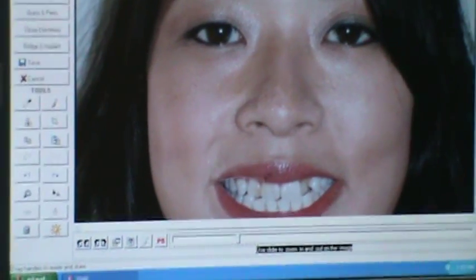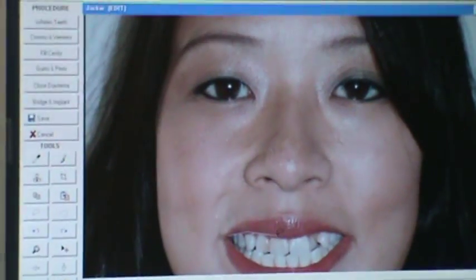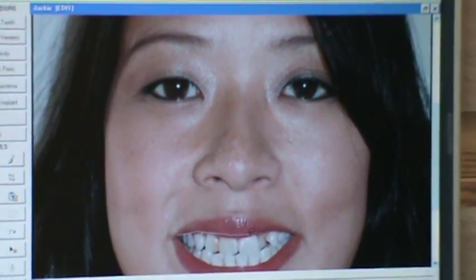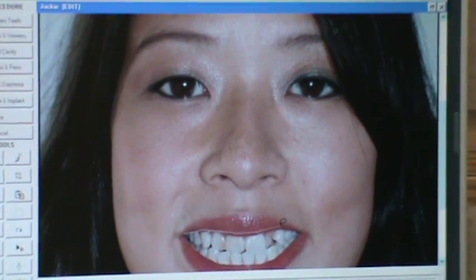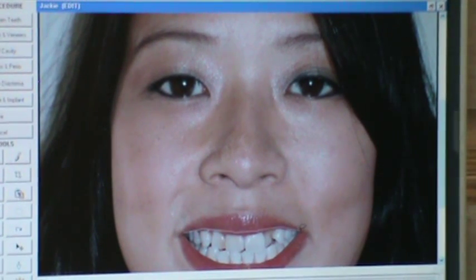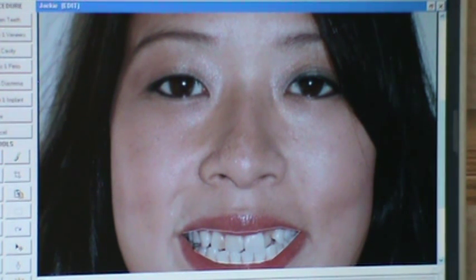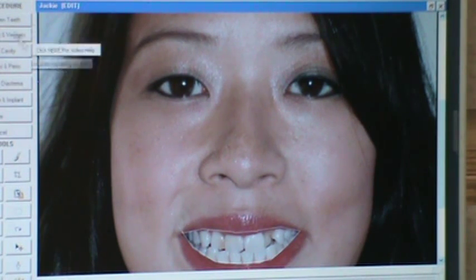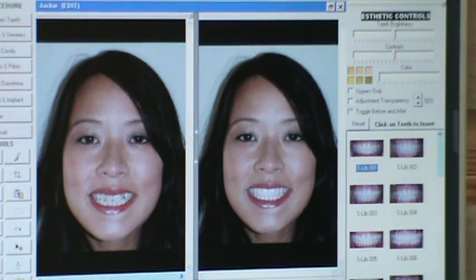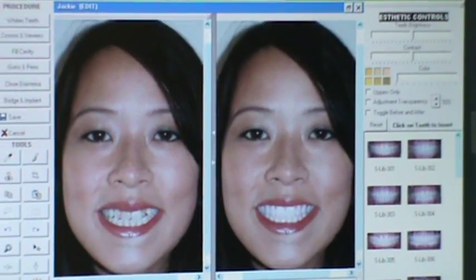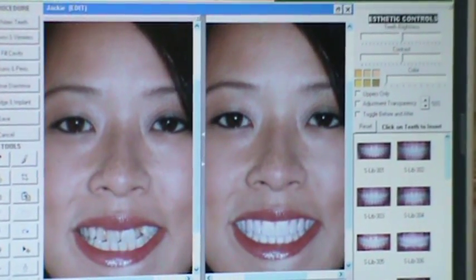What I do is I go in with a mouse and we trace the innermost portion of the lips, going all along right along the teeth. And when we get done doing this, we're going to use the specialized software to allow the computer to fill in an after result.